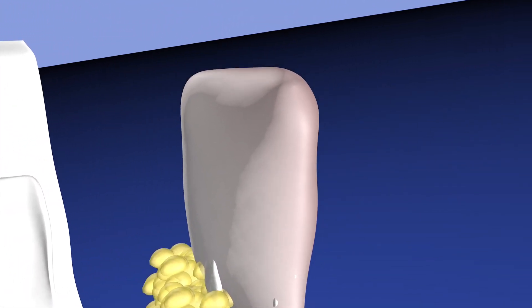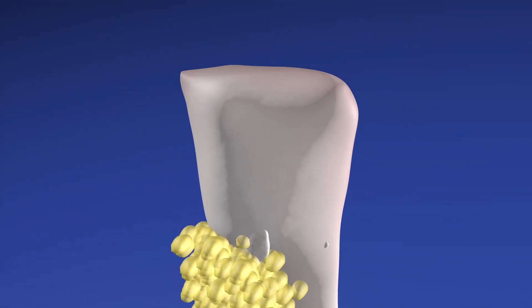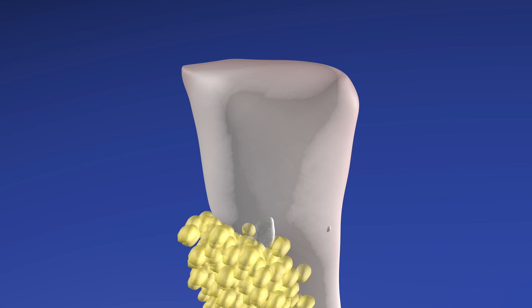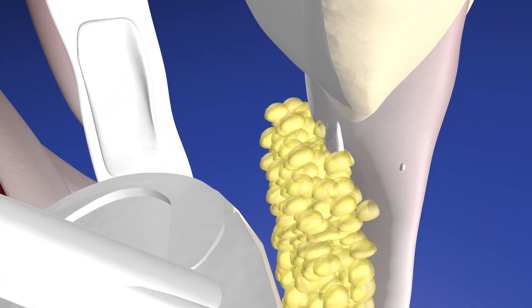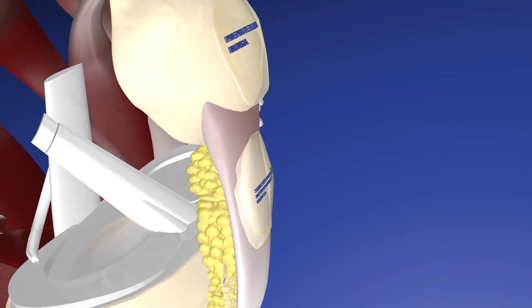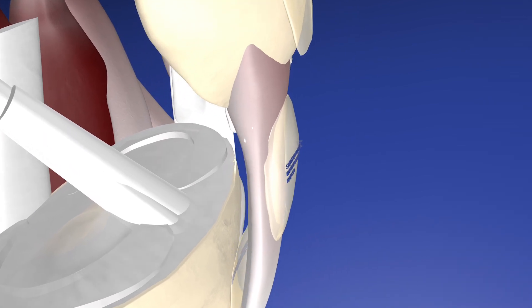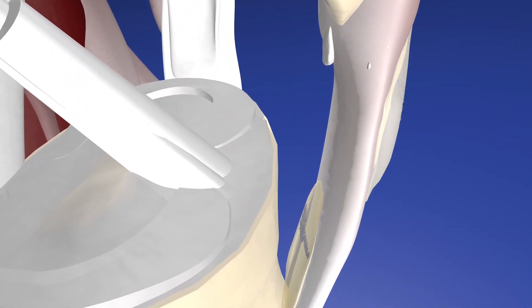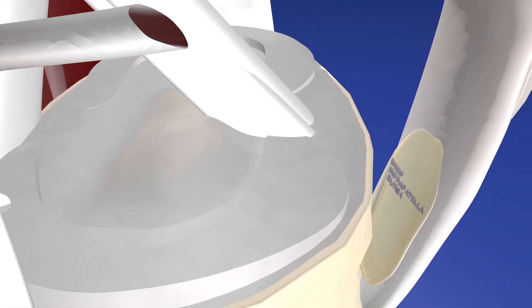Here's the backside of the patella tendon which is again thickened, and you can also see a calcific density on the undersurface of the tendon as well. Here's some of the bursae that are pertinent to this area: the prepatellar bursa, the subcutaneous infrapatellar bursa, and the deep infrapatellar bursa.